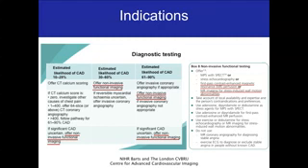Now, even if you offer an invasive coronary angiography, you may still find some ambiguity whether there's significant coronary artery disease, whether an artery is actually significantly narrowed to warrant treatment. So in those cases, you can then offer non-invasive functional imaging to see whether the stenosis is actually significant and causes either a perfusion defect under stress or a wall motion abnormality under stress. And again, MRI is just one of the choices you could offer.